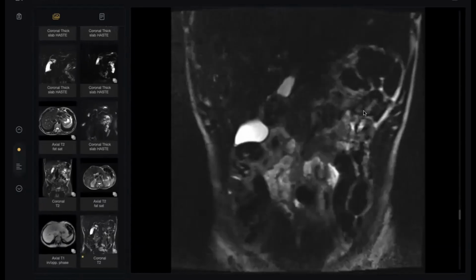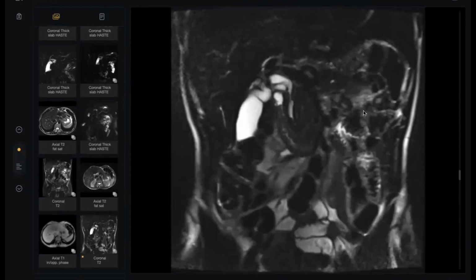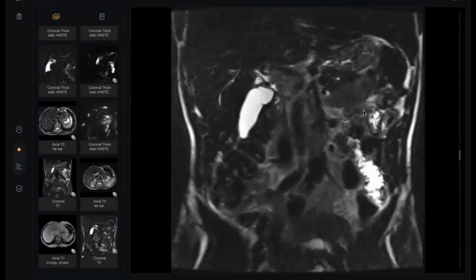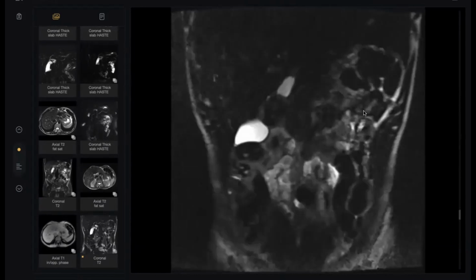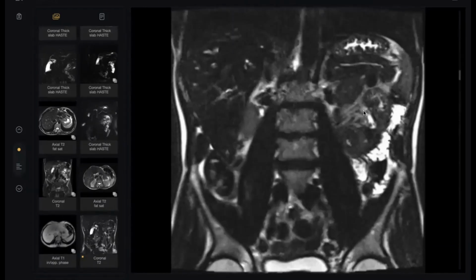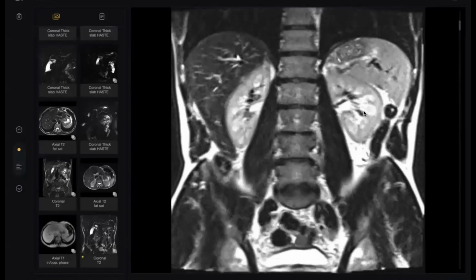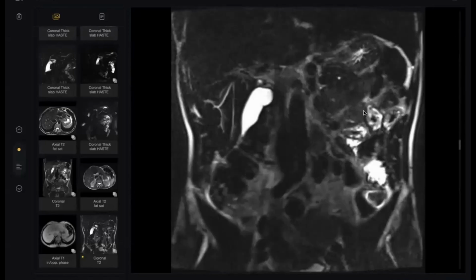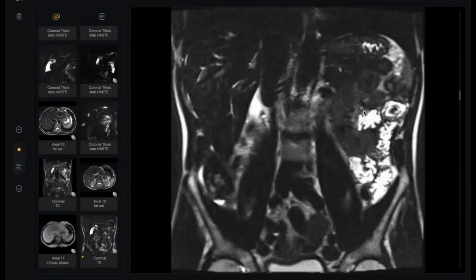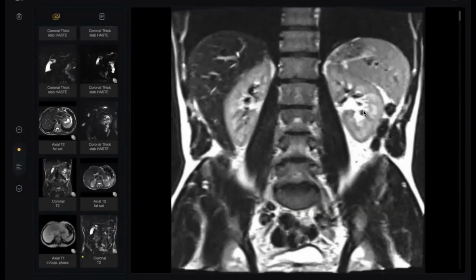Look here. Do you find any clue? Yes sir, I'm looking. Do you find any clear clue for Crohn's? I could not. Okay, thank you, doctor, so much.